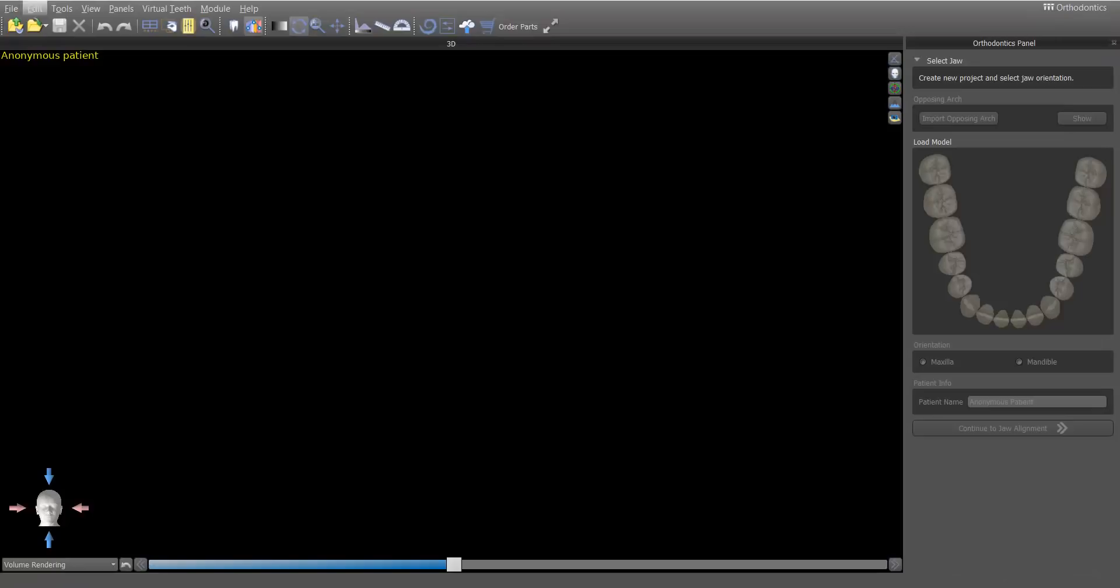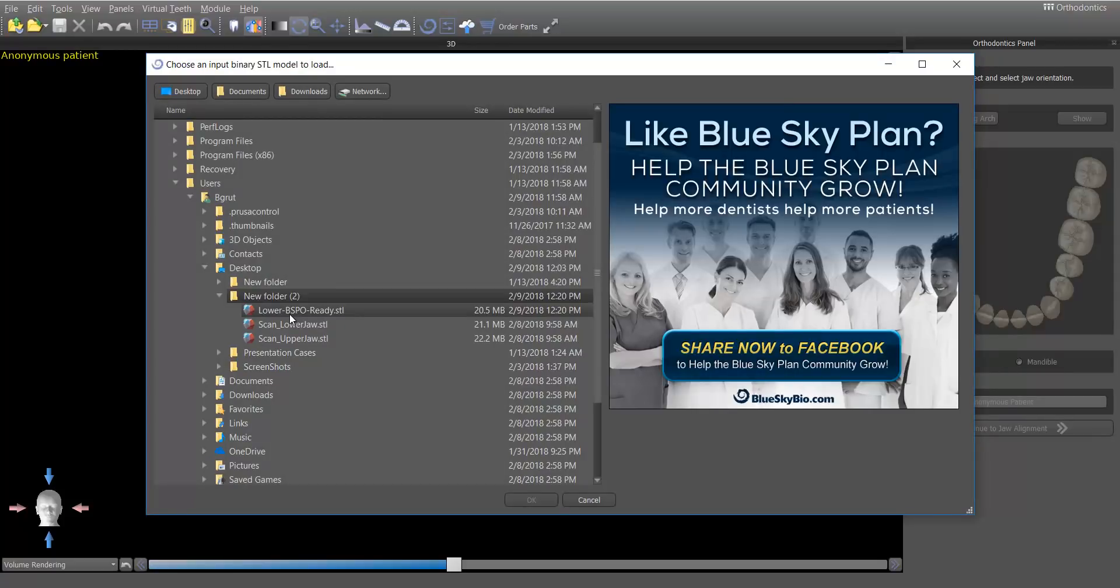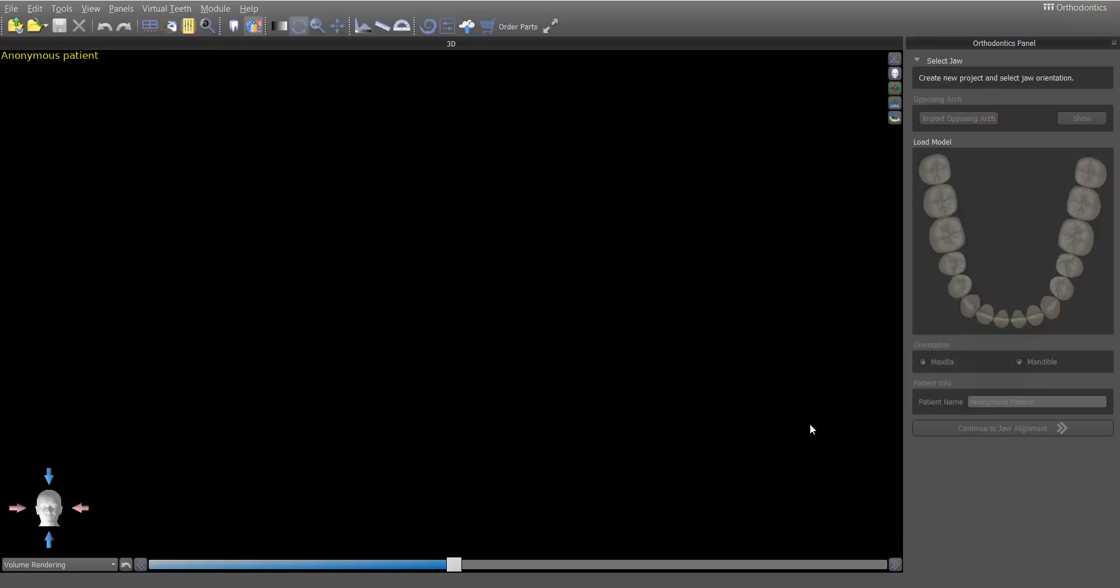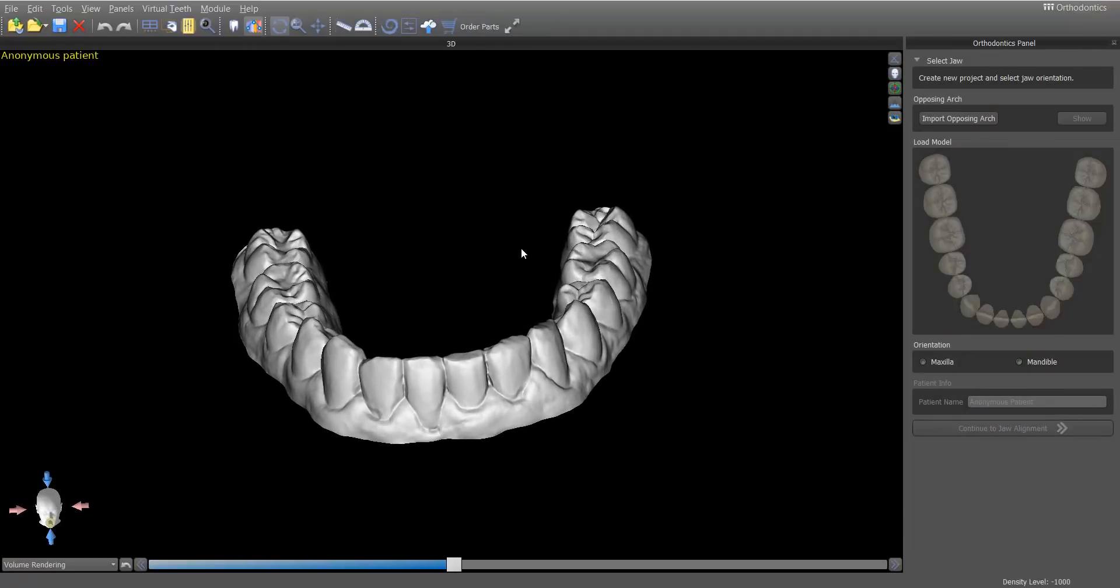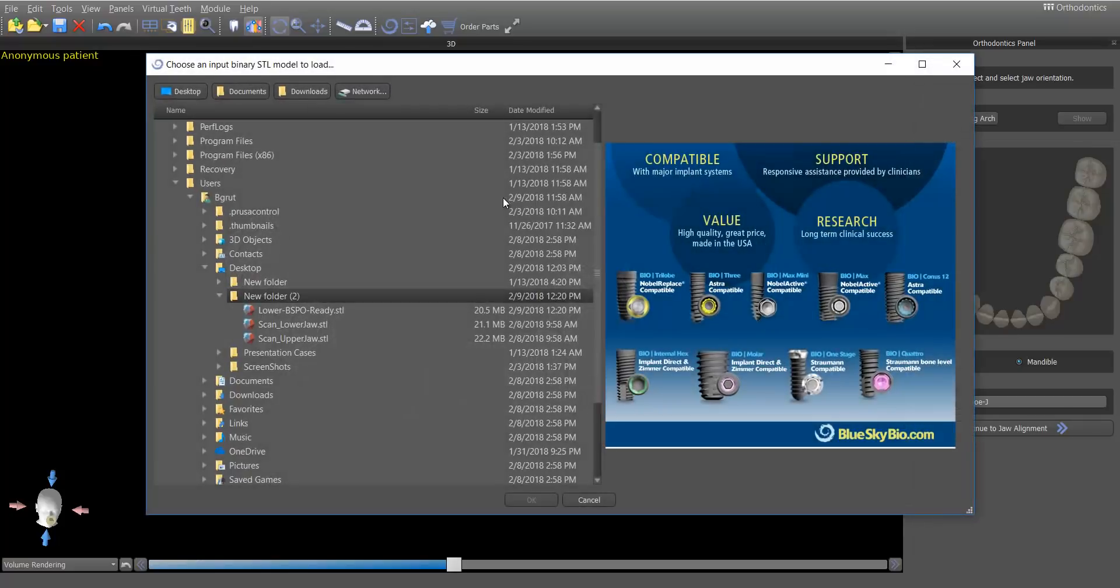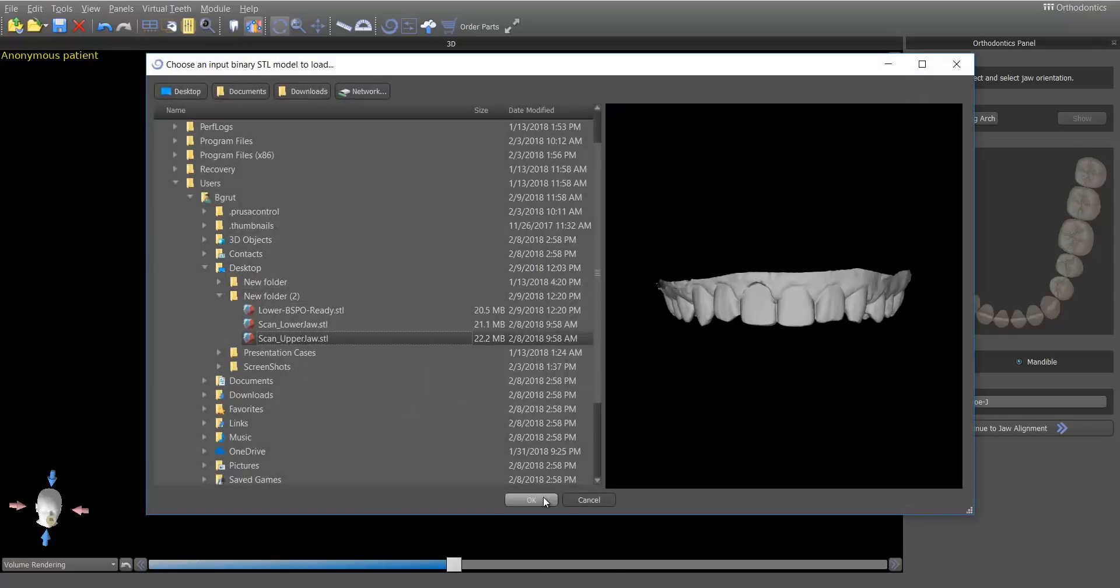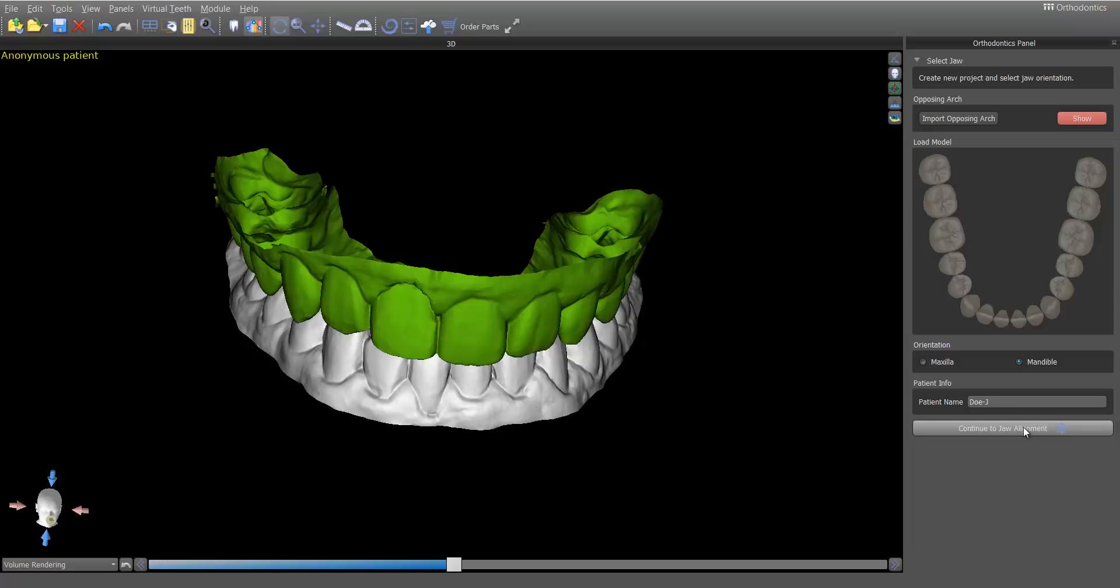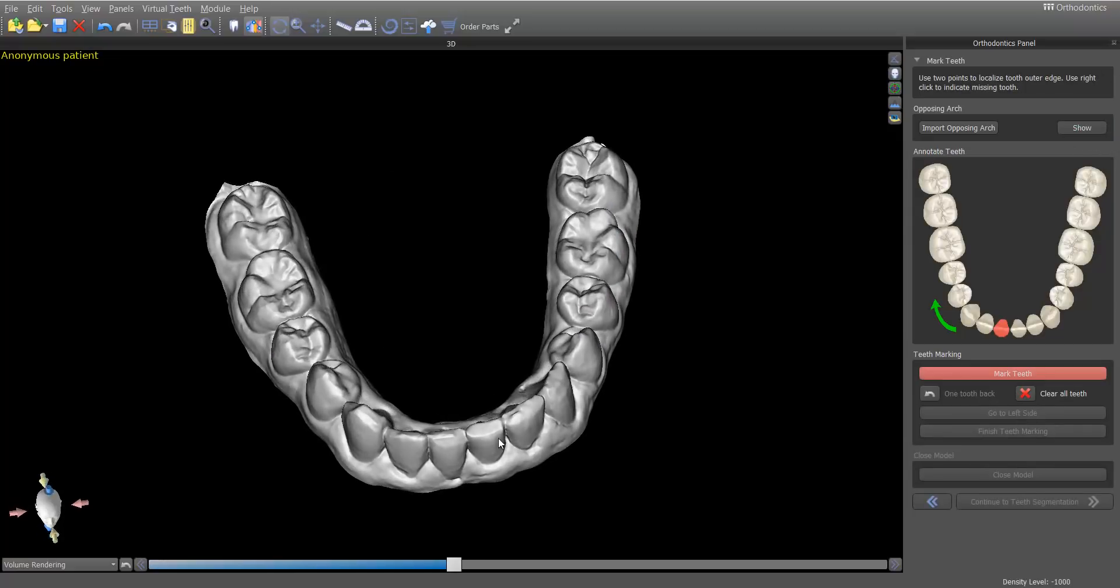So, now I'm in Blue Sky Plan, and I need to open up that model. So, I'm going to click on this opening button, and there's my model. And I can click OK. So, here's the deal. When I tell it, it's a mandible, and this patient's name is Doe J. And I can go ahead and import the oppose, and that's irrelevant, really, for what I'm going to show you. But, let's hide that. Move forward.